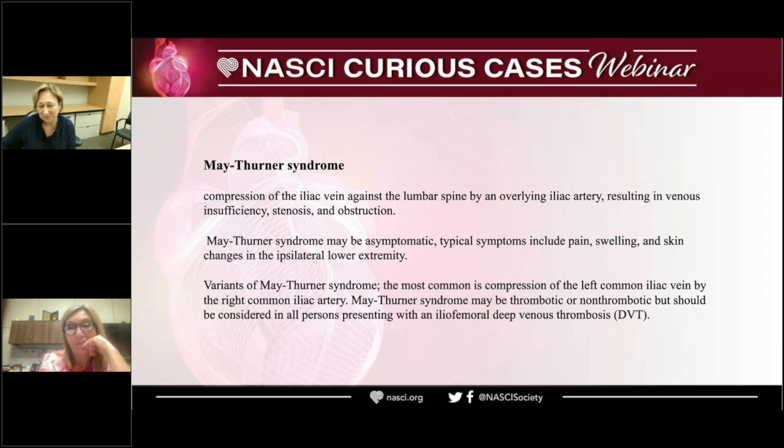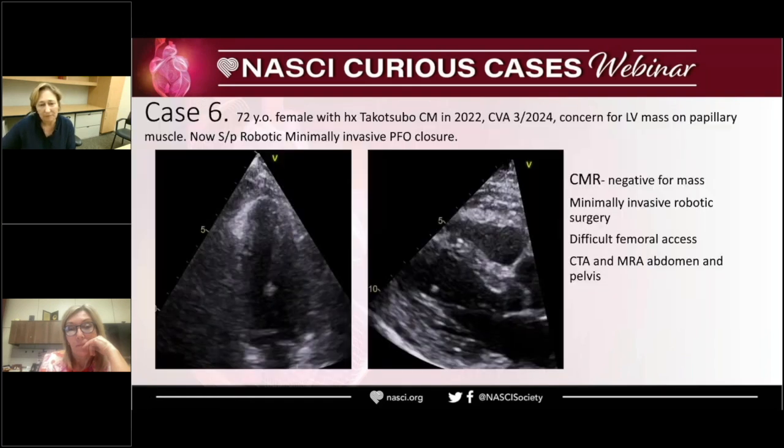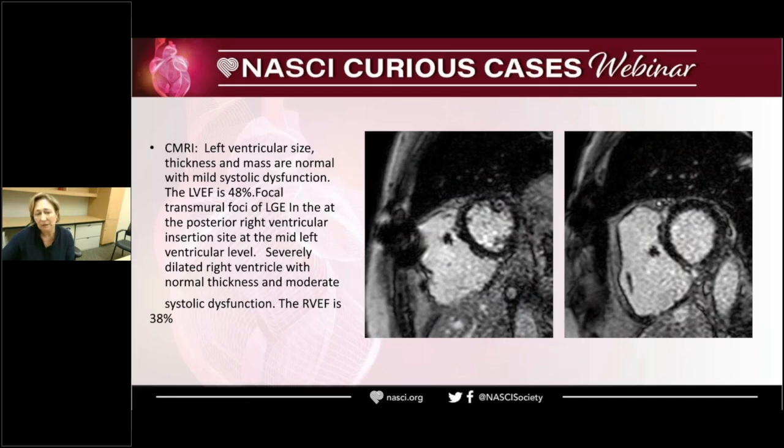I was curious if you saw any LGE in the RV wall on that ARVD case, or ARVC. So these are the images of the LGE. These are the most representative ones, and all we saw here is this anterior and inferior septum. This is the basal mid-ventricular segment, basal segment. And then really not much, except, you can argue, maybe a little bit subendocardial here, but it's similar to the blood pool. Really not sure.